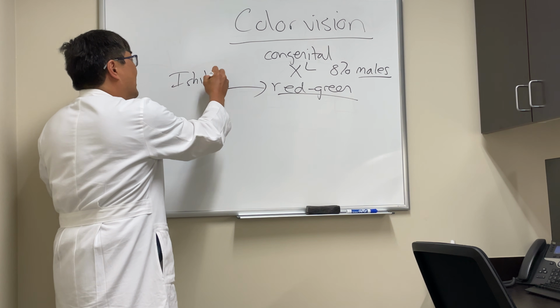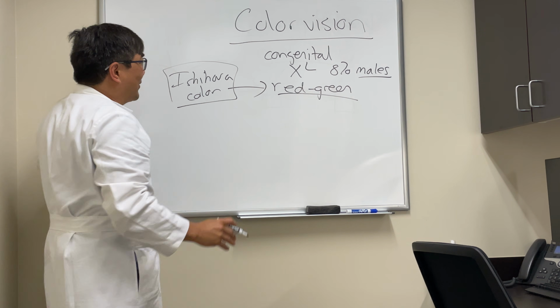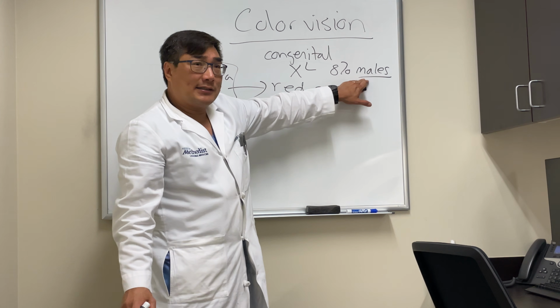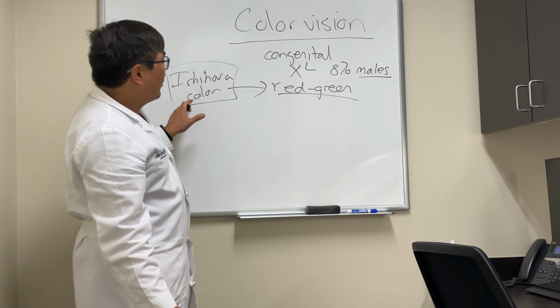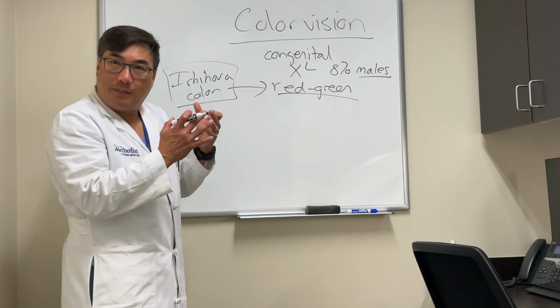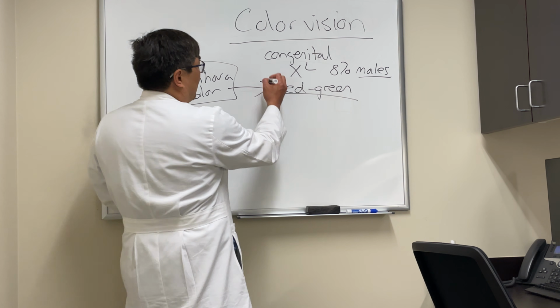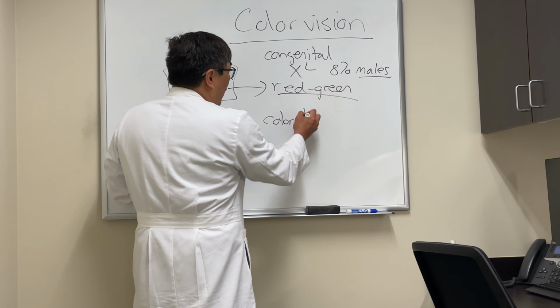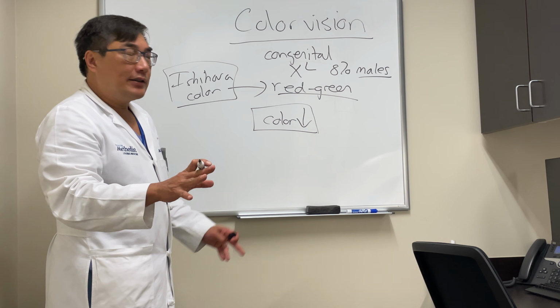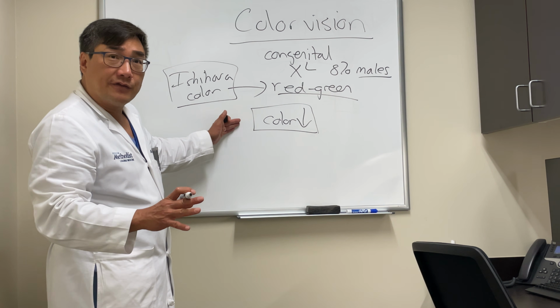So the color plates that we have, Ishihara most commonly, are designed to detect congenital red-green color blindness, X-linked in males. However, we use these plates for acquired dyschromatopsia in neuro-ophthalmology clinic, and it's kind of our secret weapon, because the reason the color vision is important is the color goes down sometimes before the acuity. And so conditions like optic neuritis tend to affect the color vision first.